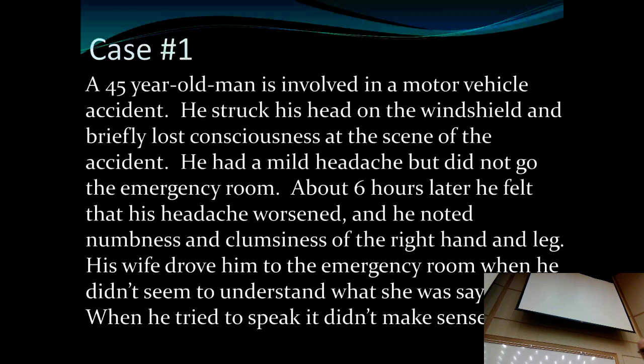All right, so let's go through a case or two here to get started. So we have a 45-year-old man involved in a motor vehicle accident, struck his head on the windshield and briefly lost consciousness at the scene of the accident. He had a mild headache, but did not go to the emergency room. About 6 hours later, he felt that his headache worsened, and he noted numbness and clumsiness of the right hand and leg. His wife drove him to the emergency room when he didn't seem to understand what she was saying. When he tried to speak, it didn't make sense.